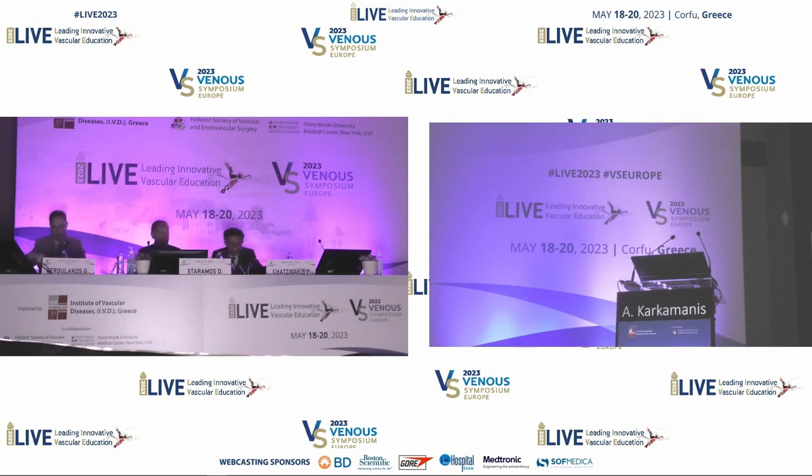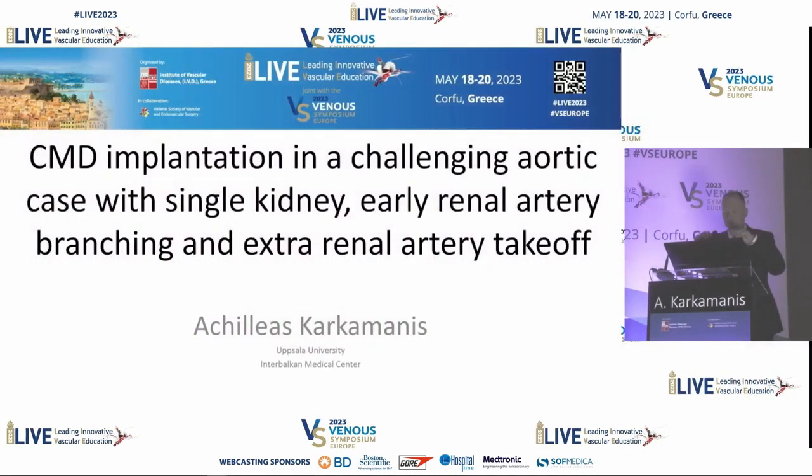The next case is custom-made fenestrated device implantation in a challenging aortic case with single kidney, early renal artery branching, and extra-renal artery takeoff from the aneurysm. Dr. Karkamanis. Thank you very much for letting me present this case for you today.